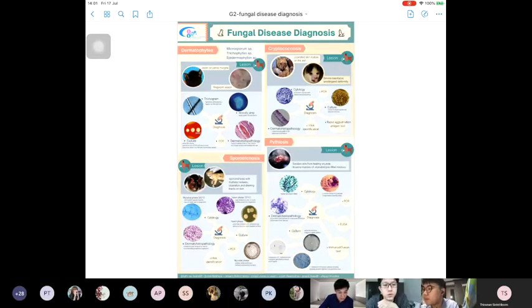For this group, I have two questions. The first is about identification of sporotrichosis by culture and VITEK. Are there any specific conditions that have to be met before you use VITEK for identification of Sporothrix species? Okay, this is a dimorphic fungus, right? I think for VITEK we have to convert it into the yeast form before we run it. Yes, we have to induce it to grow as the yeast form by incubation at what temperature? 37 degrees Celsius. Yes, because VITEK uses the single-cell or yeast form.